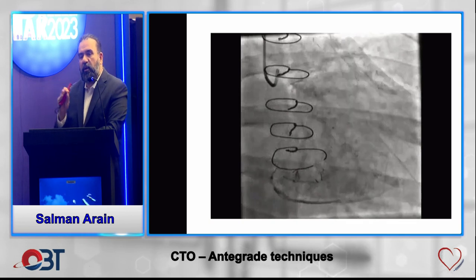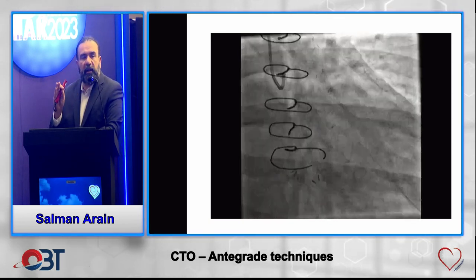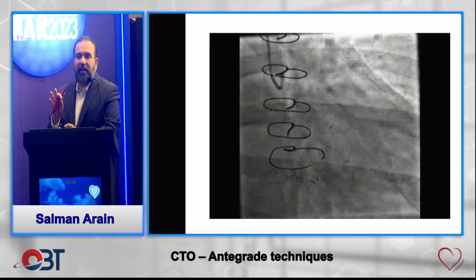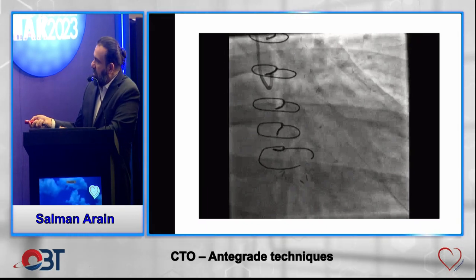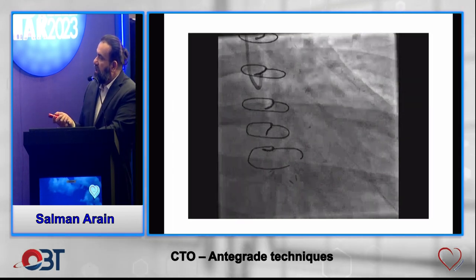in the collateral. Because the normal artery has muscular tone, so it can auto-regulate. Collaterals, often, because they are stretched out, don't have that capacity to auto-regulate. A collateral is highly dependent on the pressure coming into it. So when you have donor disease, just like we saw there, the collateral gets compromised. But at least there's an option if you wanted to go retrograde.